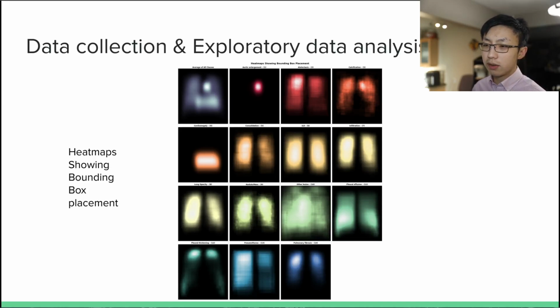And we can immediately observe significant biases in all of these. For example, in the top row, second from the left, we can see the average bounding box prediction for aortic enlargement. It's significantly biased to that particular area in the top left of the radiograph, where the heart normally is. Since it is aortic enlargement, this does make sense since it is a disease of the heart, but it also provides a problem from a modeling standpoint, as it introduces significant bias and it cannot always be assumed that the location of the heart will be exactly in that area, as different chest radiography machines and patient positioning are possible.